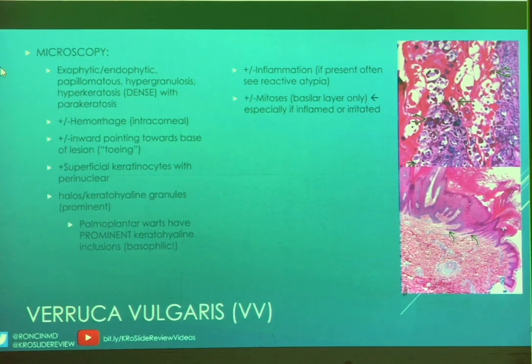Palmar plantar warts, so warts that are occurring on the palms of the hands and the soles of the feet, tend to have those really prominent inclusions, which are also kind of basophilic, even though in the picture example that I have to show you, they look a little more eosinophilic, but that's what you're looking for.